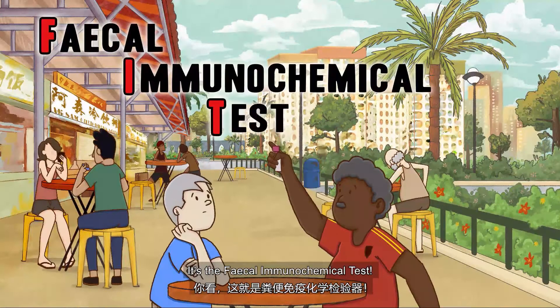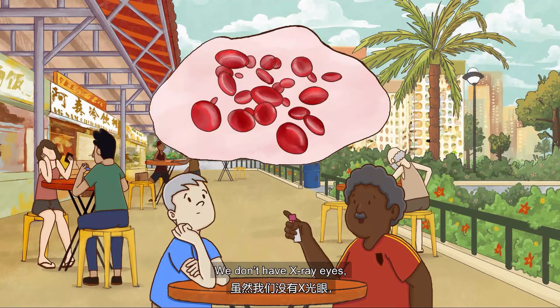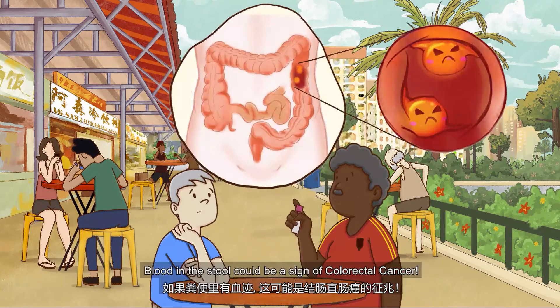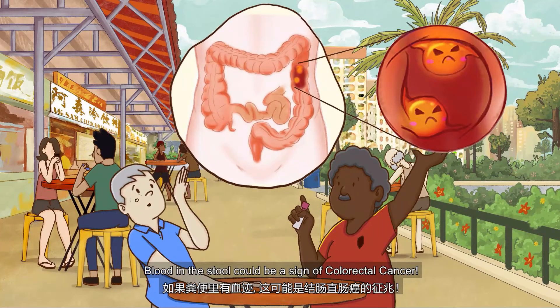It's the Fecal Immunochemical Test. We don't have X-ray eyes. This test can check whether your stool has blood. Blood in the stool could be a sign of colorectal cancer.